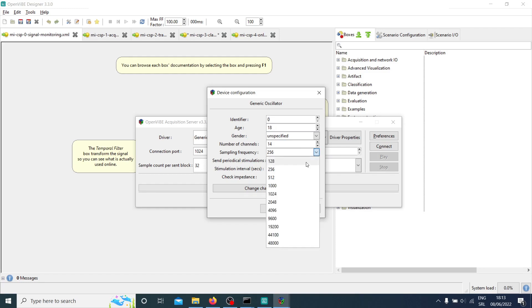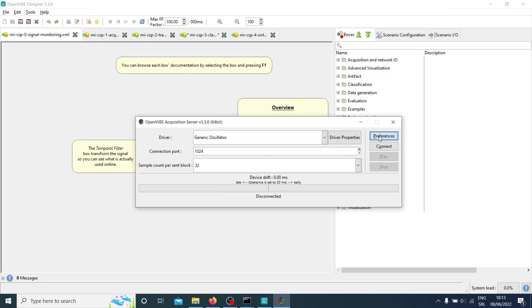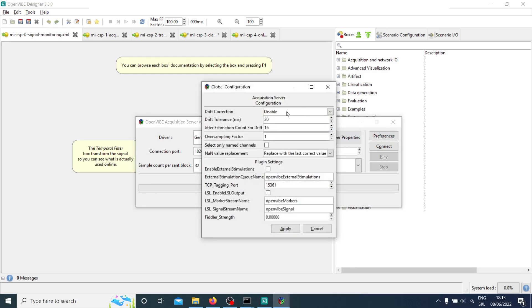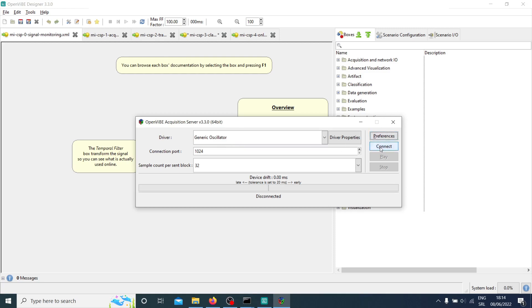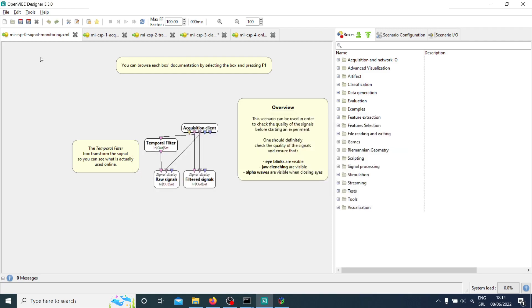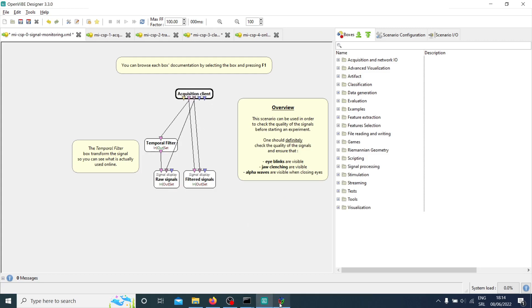The sampling frequency — typically EEG devices run at 256 or 512 Hz, so let's just leave that. You don't need to correct the drift because we're not connected to a device via Bluetooth or anything like that. The tolerance settings don't really matter here since we're generating fake signals. When you start your experiment, the acquisition client receives the data that the server is sending.